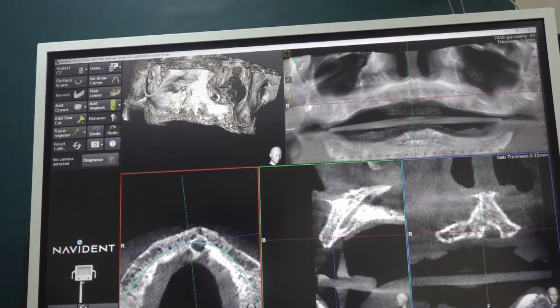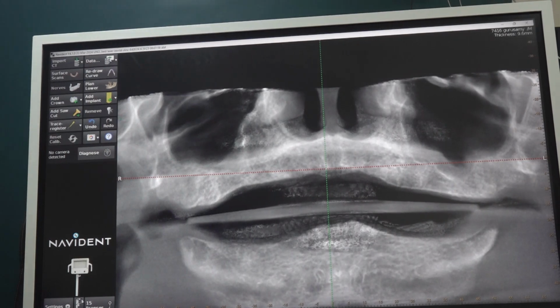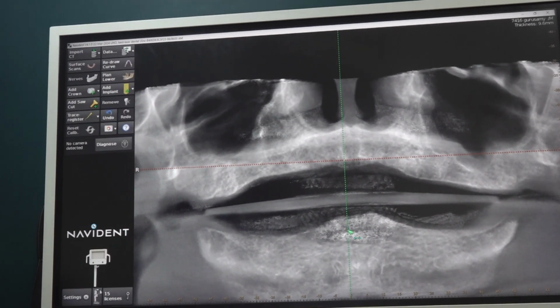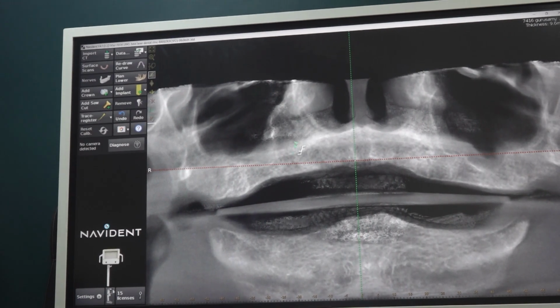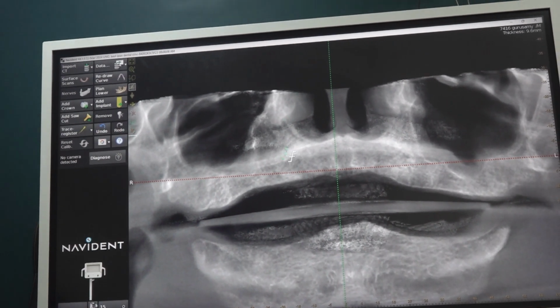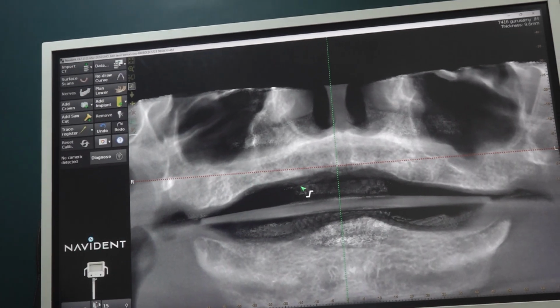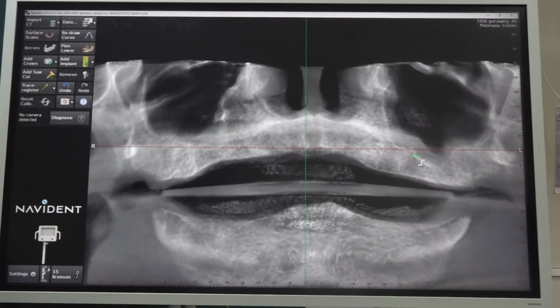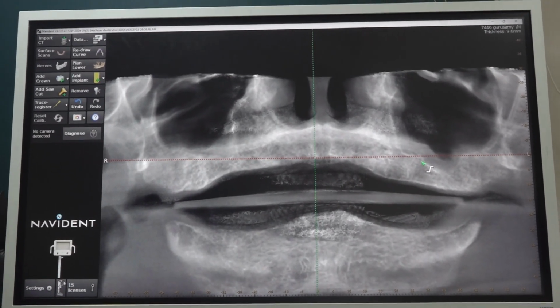So our standard plan is 2 pterygoids, 2 anterior, 2 premolar area, nasomaxillary buttress targeting the maxillaries. If we can find some good bone in the molar area, we can avoid pterygoid and we can place one implant in the molar area.